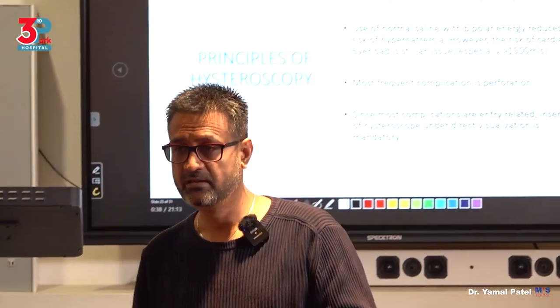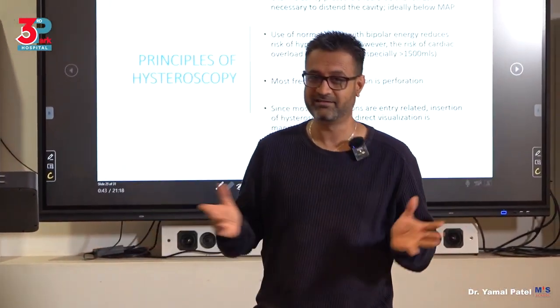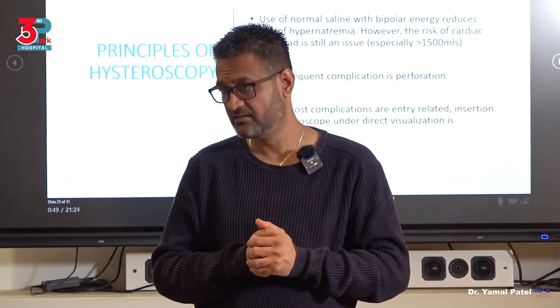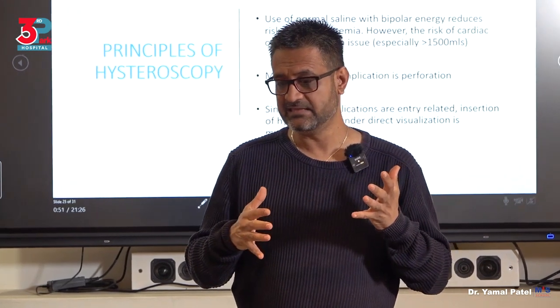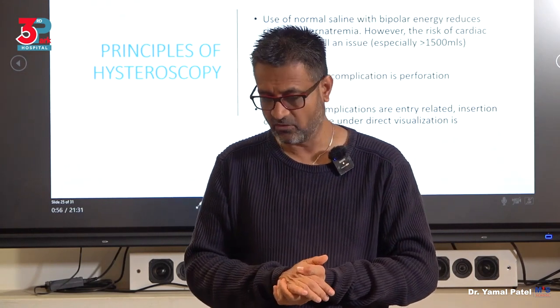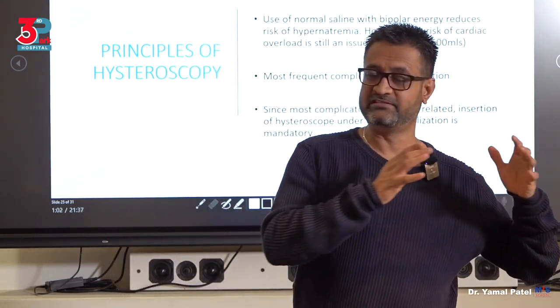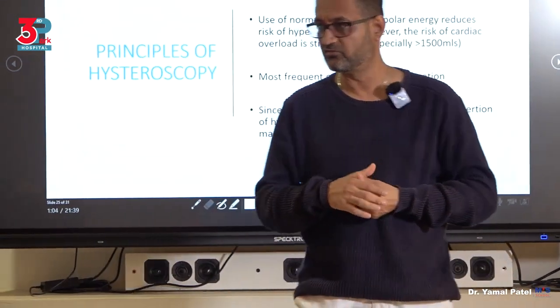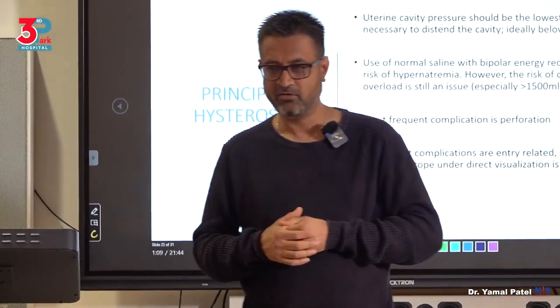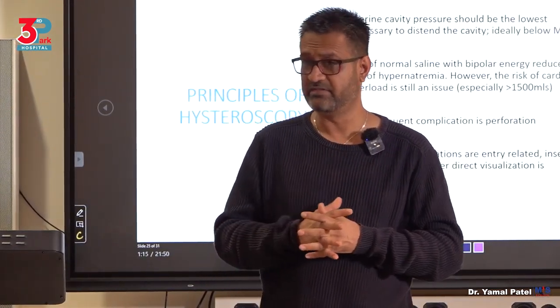anatomy of the hysteroscopy. So you should know what is the normal anatomy of a uterus and what are the abnormalities that you can come across, including pathology. Then there is fluid distension media. How do we do it? There is the actual demonstration on the equipment itself. And then there are also complications of hysteroscopy. Then there is what is challenging hysteroscopy. So maybe challenging hysteroscopy, I'll take you through if there's time now. But challenging is not every case will be straightforward. So how do you come across and deal with those challenges whenever they happen?